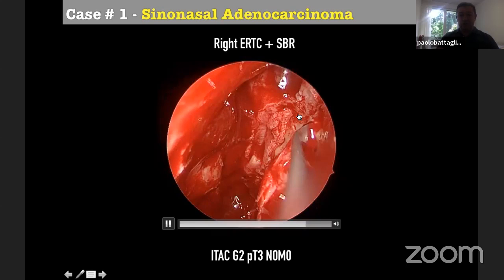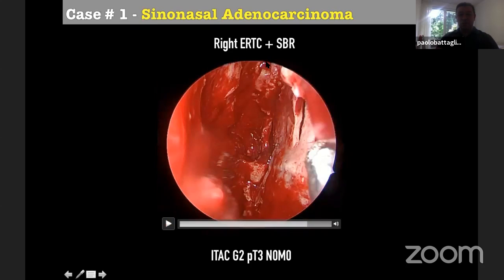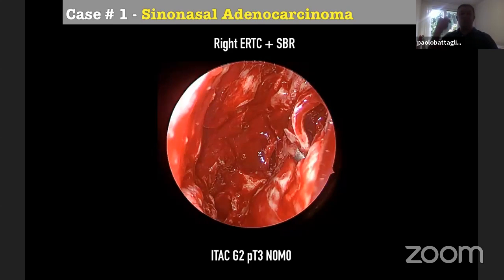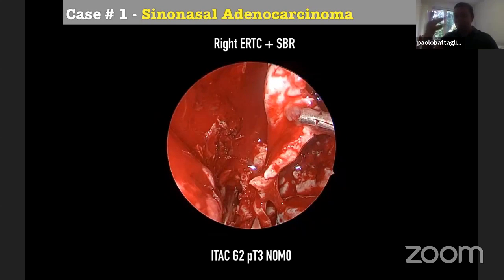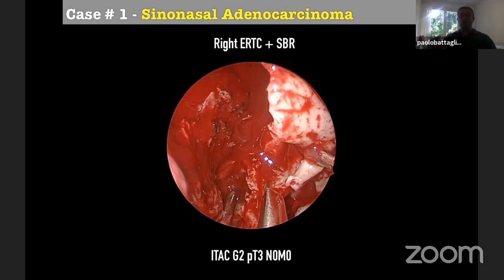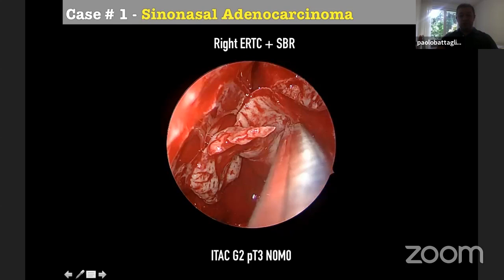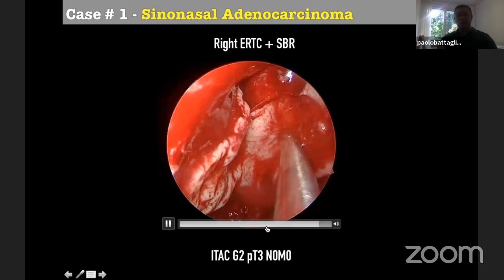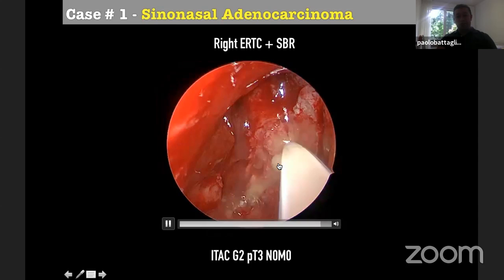So anterior incision, again, here is the posterior wall of the frontal sinus. Here is the incision, it is more anterior and then turns posteriorly. But don't go straight, if not it will be a failure. Over here you can use a beaver, you can use a monopolar, we don't use it, but if you are confident, let's use it. You can use a diode laser, use what you want. And here posteriorly, we cut the posterior incision, it's at the level of the anterior wall of the sphenoid. And as you can see, we turn the flap up.